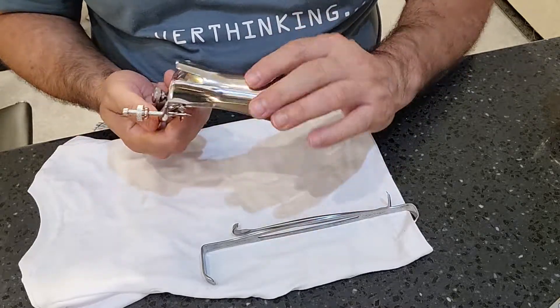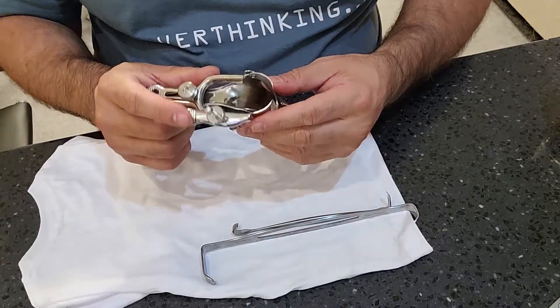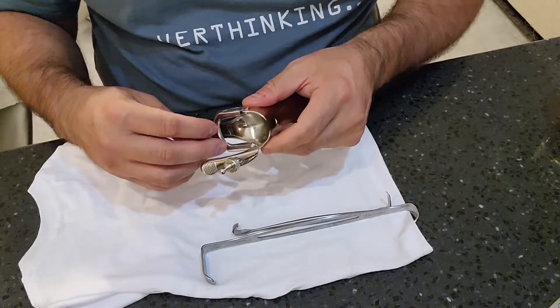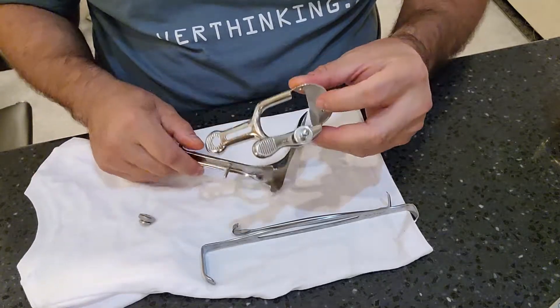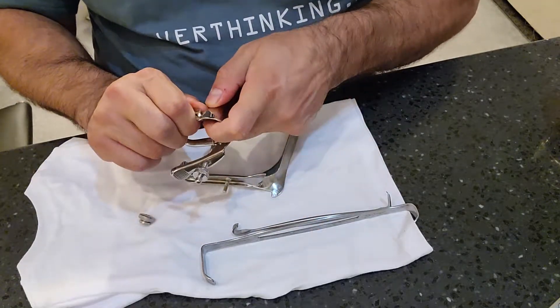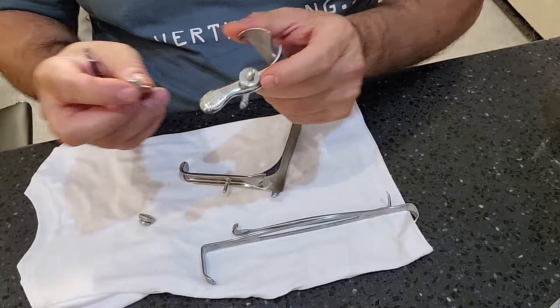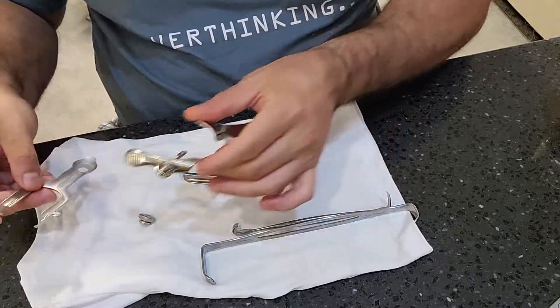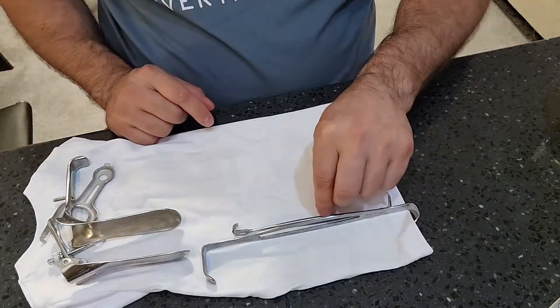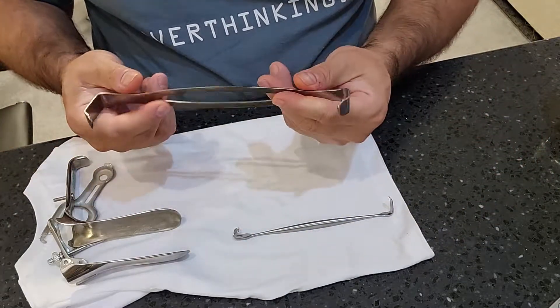Then you have speculums such as this vaginal retractor, used to retract the walls of the vaginal area. This one is more complex — there are multiple moving parts, screws, and bolts. It comes apart in one section while the other screw has a hard stop on it, and the head can be removed from the working arm for further disassembly.